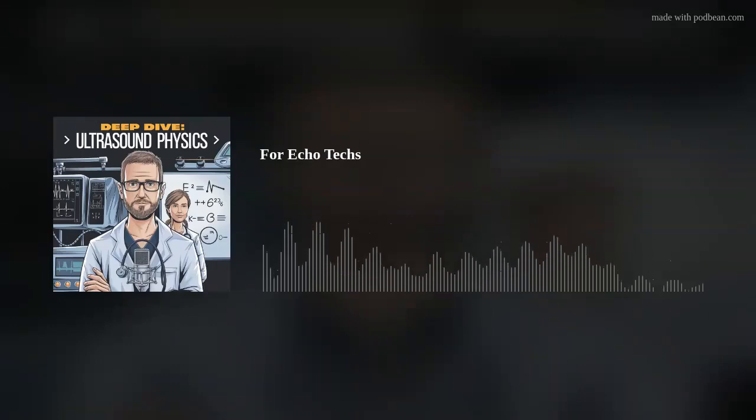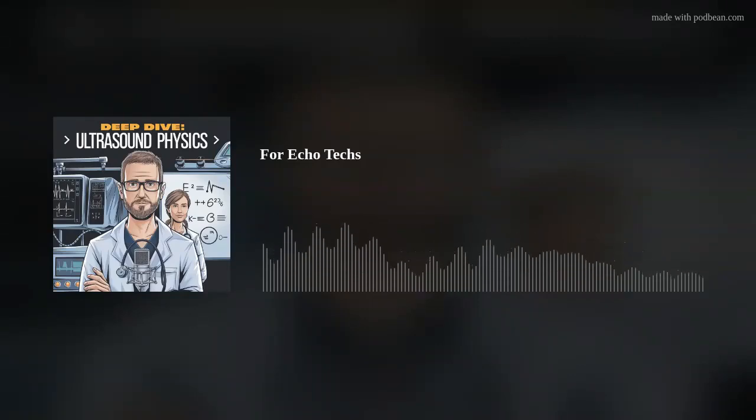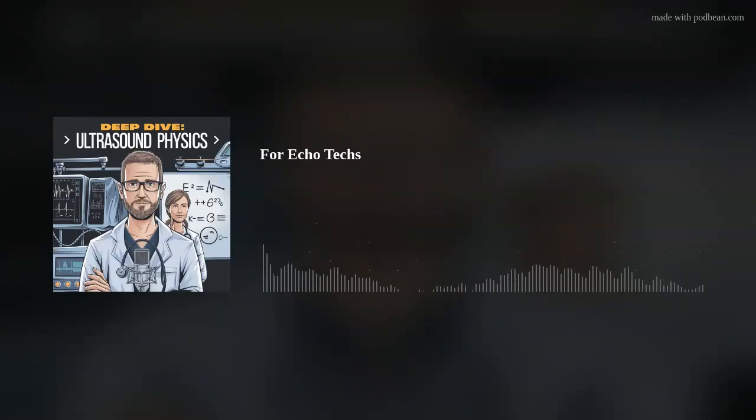We've talked about valvular disease, congenital defects, pericardial effusion, and cardiac tumors. We have. But there's a whole other area of echocardiography that's pushing the boundaries even further. Advanced techniques. That sounds intriguing. Tell me more. Well, one exciting area is stress echocardiography. Instead of looking at the heart at rest, we can see how it functions under stress.